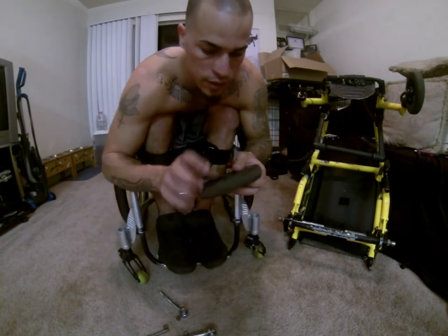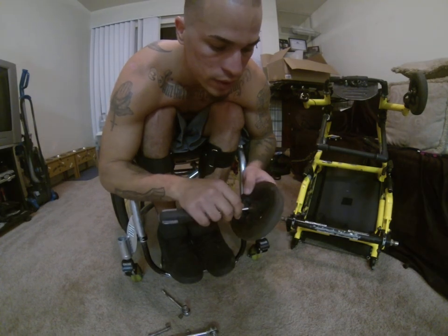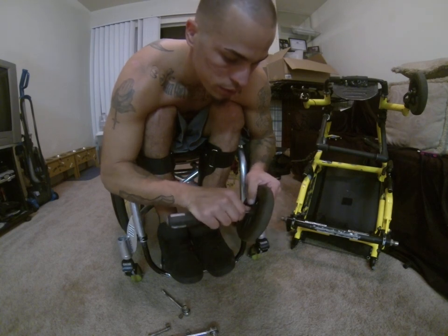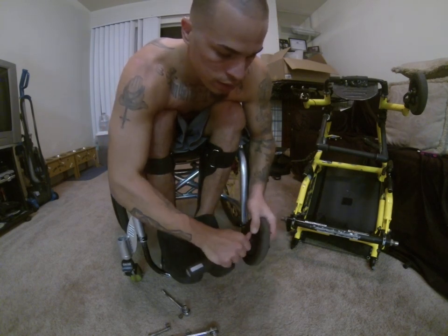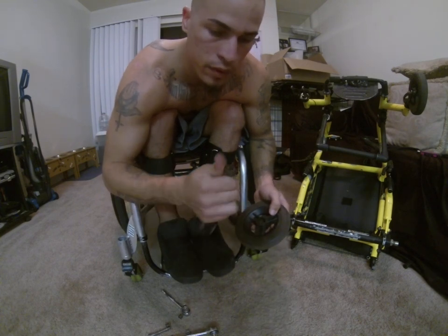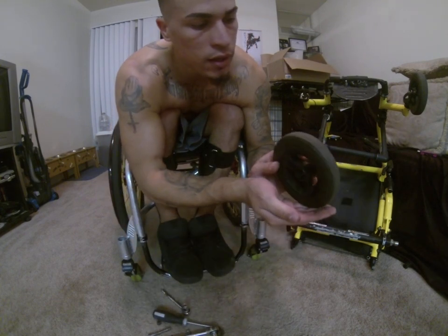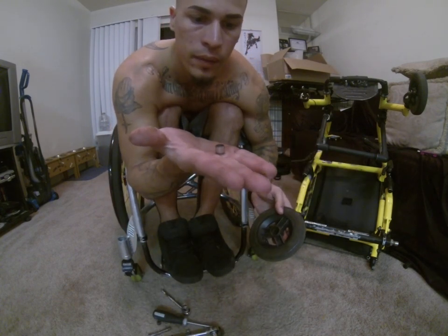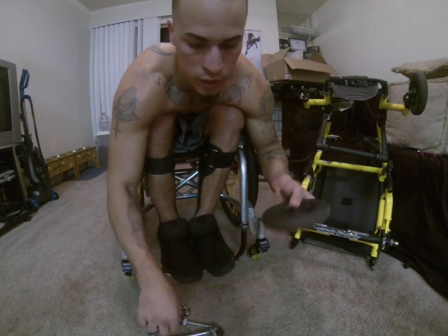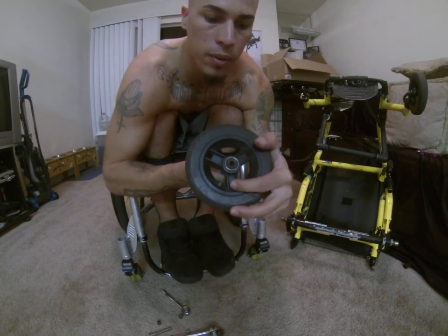Alright, so now I gotta find something to pop this out. So I'm going to use a screwdriver. If they're too rusted, they're really hard on there. If you have WD-40, try using some WD-40, lube it up, and it'll pop right out. Like that. See? All rusty and dirty. And then inside, you have another spacer, a little washer, alright? And then the other one, you can just pop it out with something else. And it should just pop out right there.